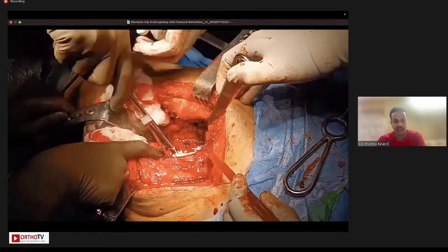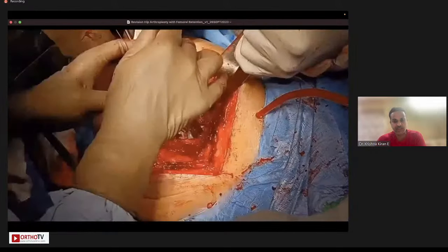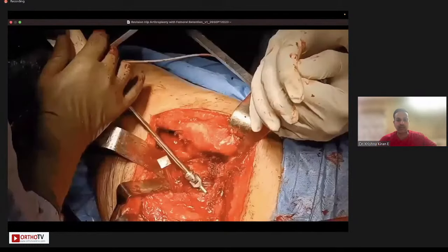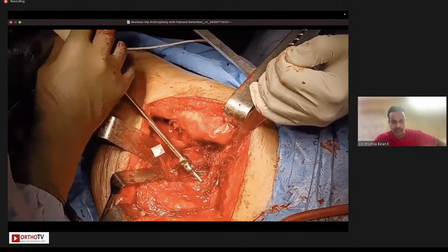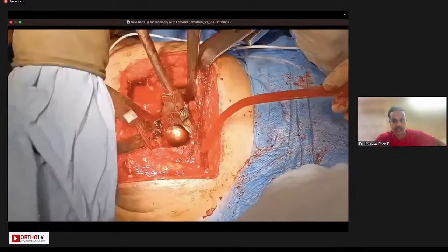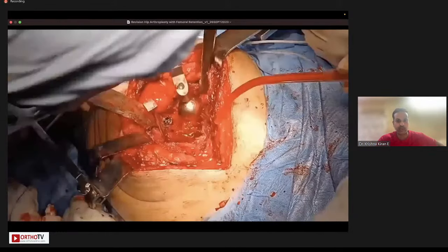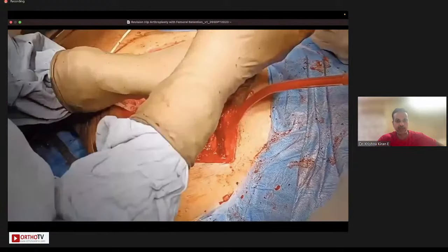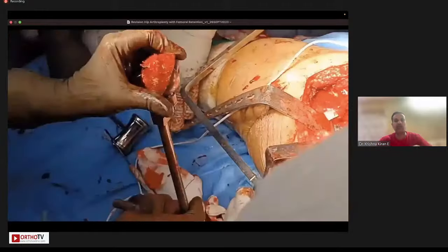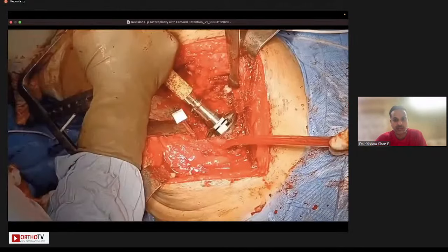Typically, the polyethylene liner is removed using a single screw which is drilled into the periphery. And with the help of the osteotomes, and then the screws are removed. And we use this explant device to slowly try and take the cup out. So you have long and short blades which allow us to cut the implant at the junction of the bone and the implant interface. And once the implant is removed without any damage, we can typically use a cup which is around 2 or 4 millimeters larger.